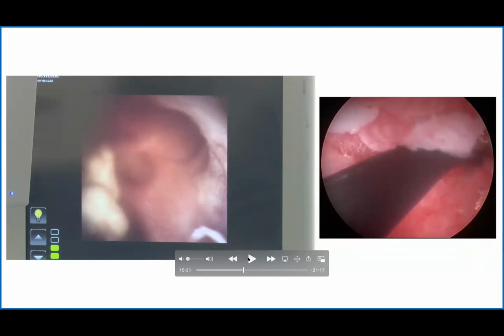Yeah, I think the question was that the pressures are higher when you do a mini PCNL, and so there have been some studies which have shown an increased risk of infection, but I would say that we probably don't do enough mini PCNLs ourselves to see that coming through in post-op cases. And then she's also asked about whether you have your outflow off whilst using suction to stop collapse of the collecting system.